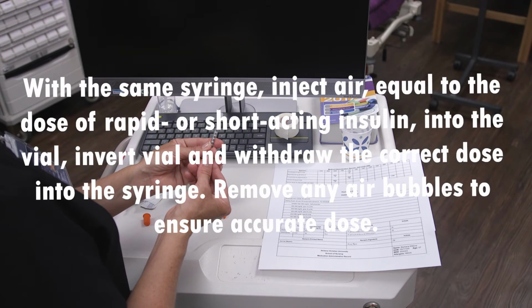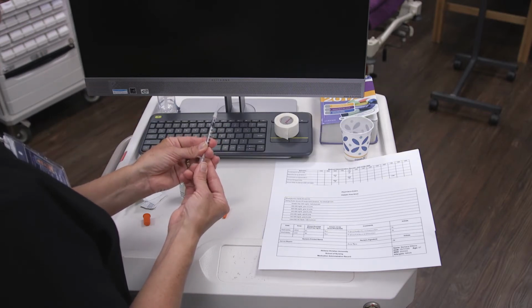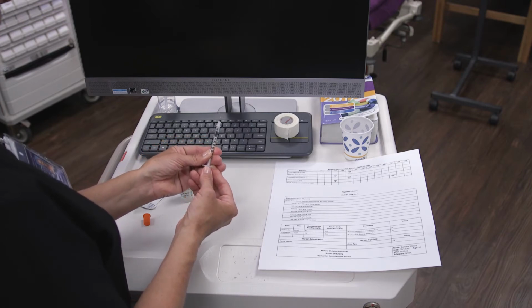With the same syringe, inject air equal to the dose of rapid or short-acting insulin into the vial, invert vial and withdraw the correct dose into the syringe. Remove any air bubbles to ensure accurate dose.